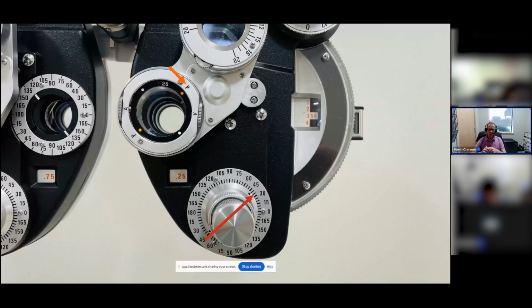And the reason that we're adding more minus power is because the patient said that this was the best option. Where you see lined up on that line between the two P's, if you were to draw a line between them, the dots that are there are the orange or red dots. And so the patient liked more minus cylinder power, so you're going to add more minus cylinder power. If it were the white dots, because you're using a minus cylinder phoropter, if the white dots lined up, then you would want to decrease the amount of minus cylinder power, and you'd turn that knob to the left.